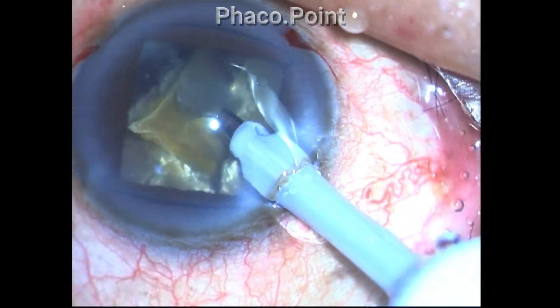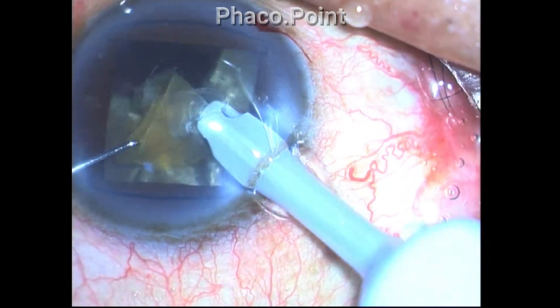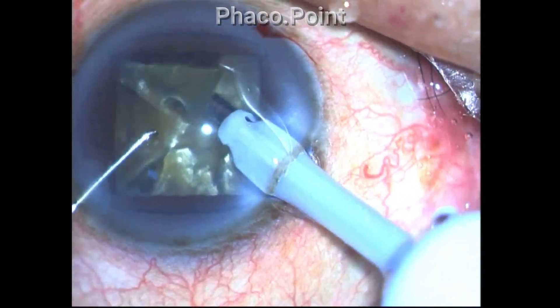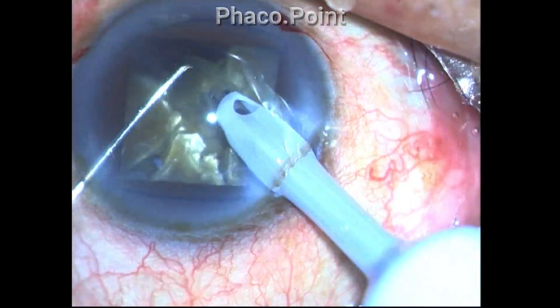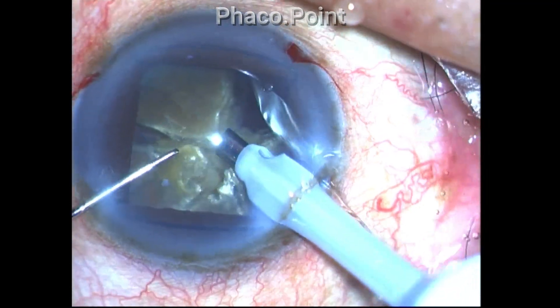Now once you have achieved the cracking of the fragments, always exchange the long chopper with a Sinski hook. This device being much smaller is more easily maneuverable within the eye, and you will not accidentally engage the nucleus and snare it while you are feeding it to the phaco tip.